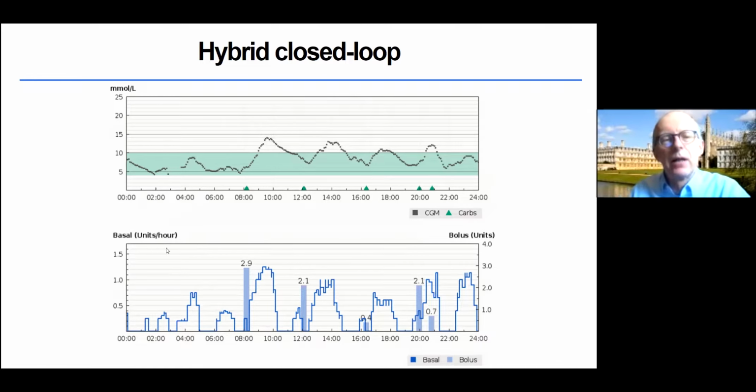And at the bottom panel, you see the insulin delivery as directed by the CAM-APS-FX app and delivered by the Dana RS pump. Again, what is important to mention here is the glucose responsive insulin delivery, unlike in the standard setup of an insulin pump. So when glucose goes up, you can see the increased insulin delivery. When it goes down, it stops insulin delivery.